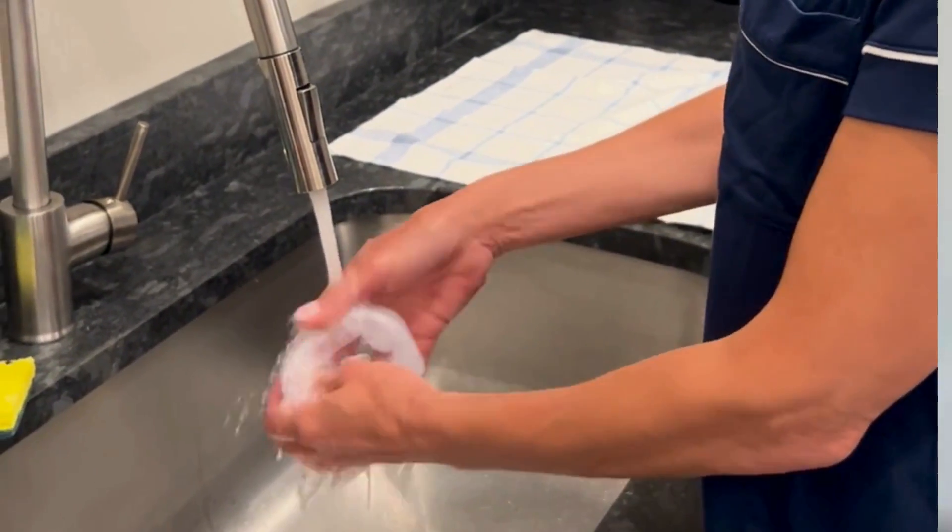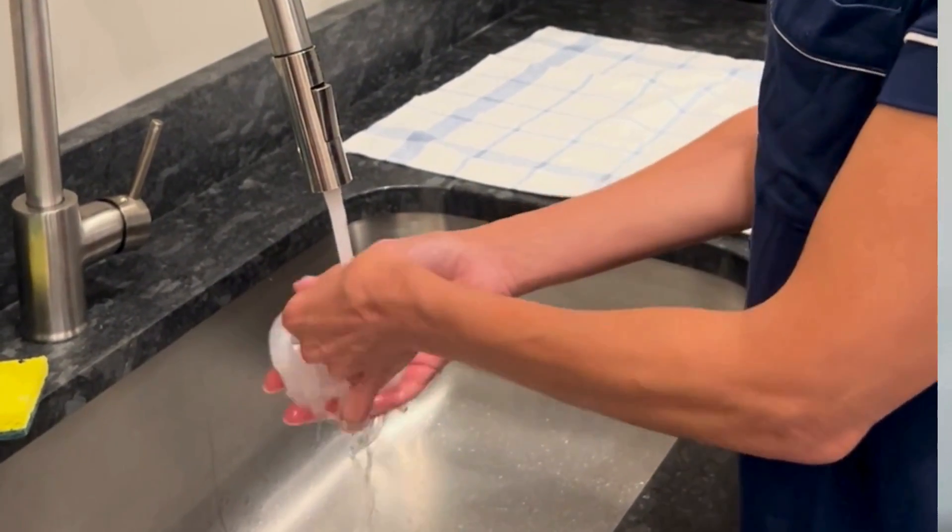Then once a week, make sure that you soak everything in warm water with a little bit of soap, wash it off, remove all the residue, and make sure that it dries.